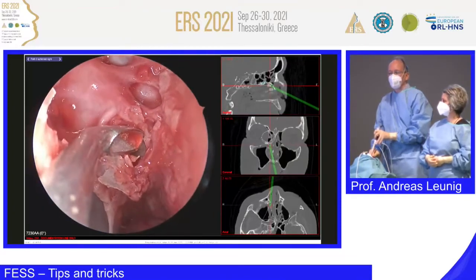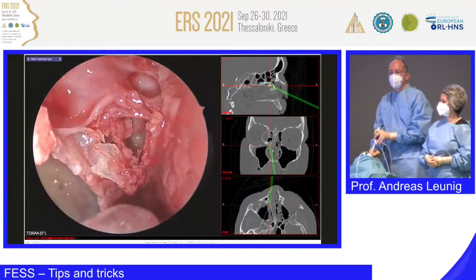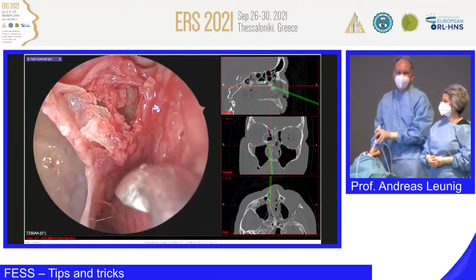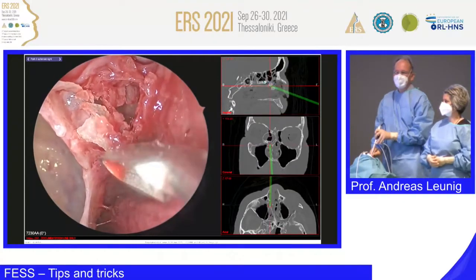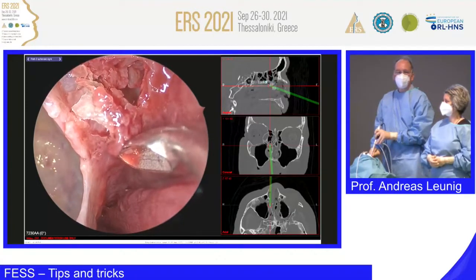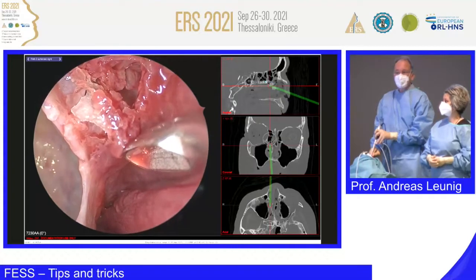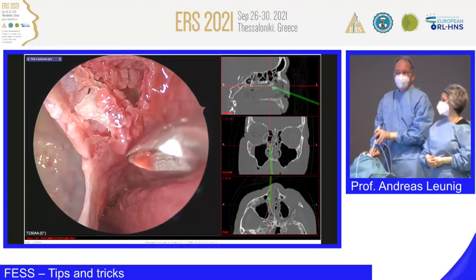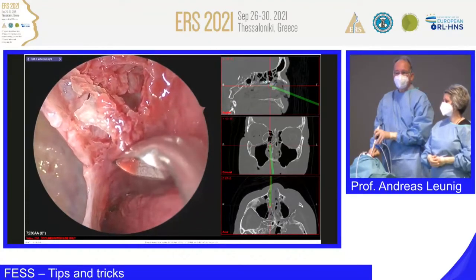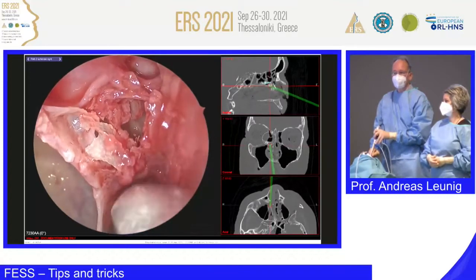We are doing a perforation in the basal lamella, but please keep in mind and make it a habit, and this is a statement not from me, it's from Heinz Stammberger. Please don't resect the ground lamella, otherwise you will have a floppy middle turbinate. You should recognize this is the stability of the middle turbinate, and keep it in place. Make it a habit, not just pulling through and rushing through.